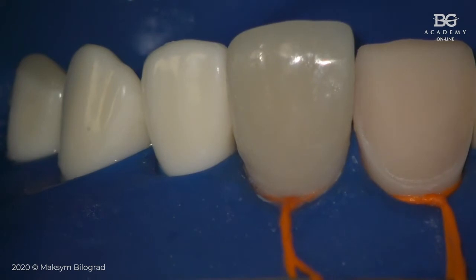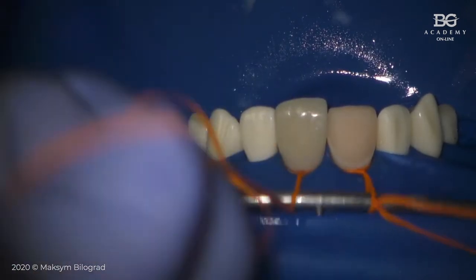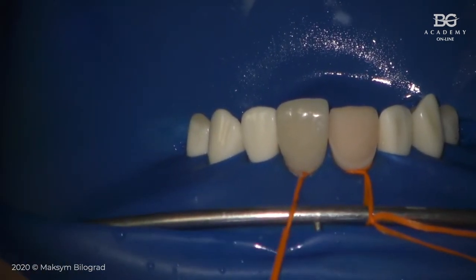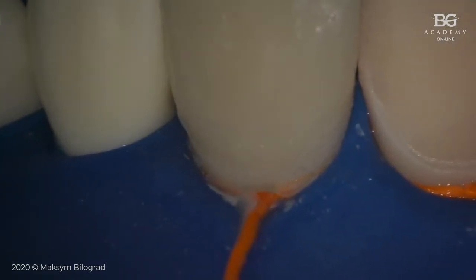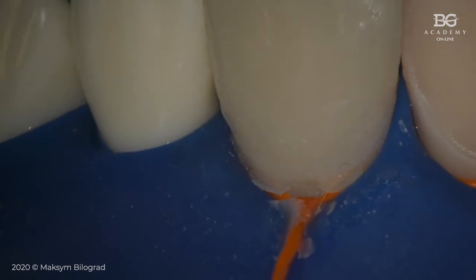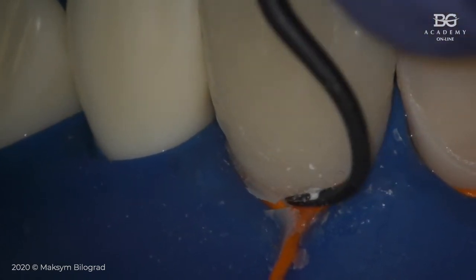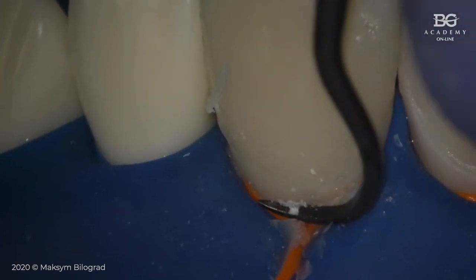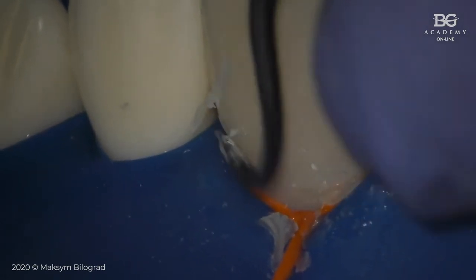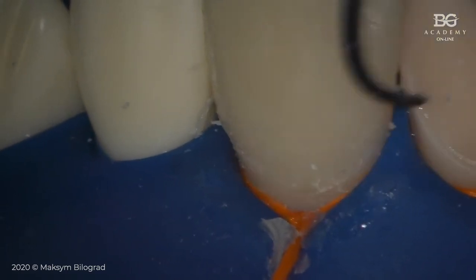So now we will do some polishing, but in this case I will show you also why we are not cutting these free ends, as I mentioned before, because I can pull them, and see what happens when I pull them. I can open more space, more area here for cleaning. I really like to work with a hand scaler like this one, so we can go really deep. We can even push floss more down with a hand scaler and get a smooth transition. Remove this bonding agent here.